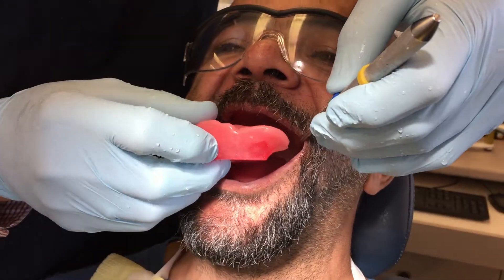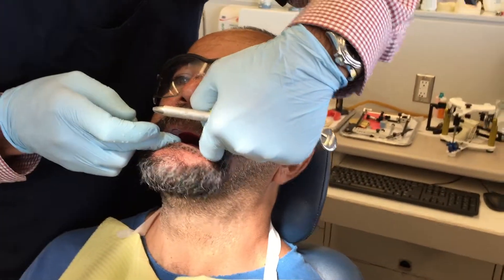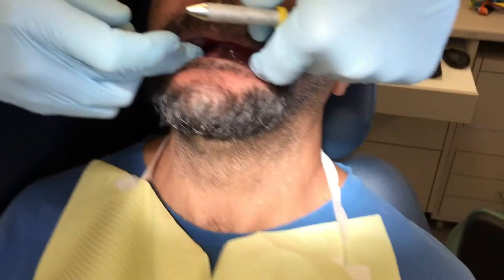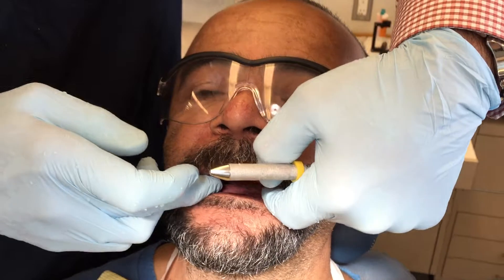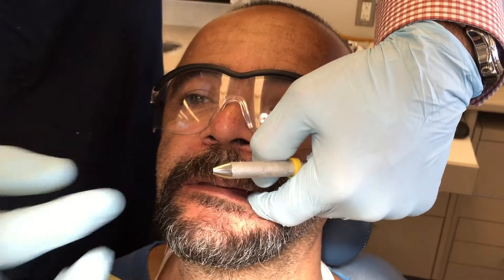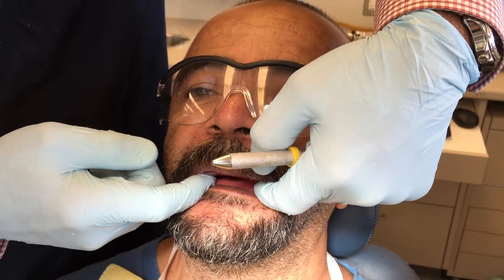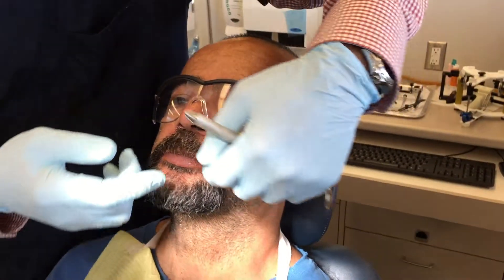We're going to rotate that in, and as you're depressing the base plate, you can hear a bit of a squishing sound as the saliva is being displaced. That's actually a good sound, because it's an indication of the intimate contact between what you've done and the tissue itself. Is that hurting you at all, Robert? No. Okay, good.